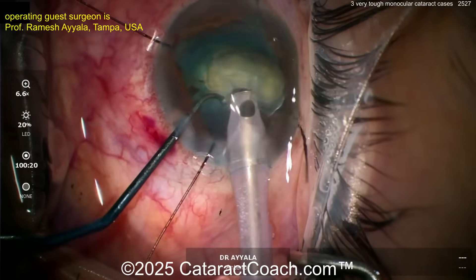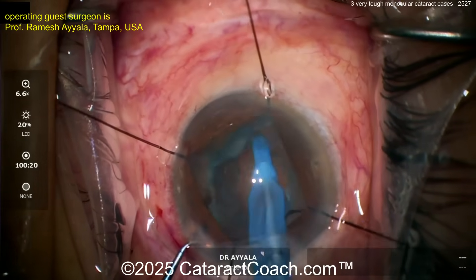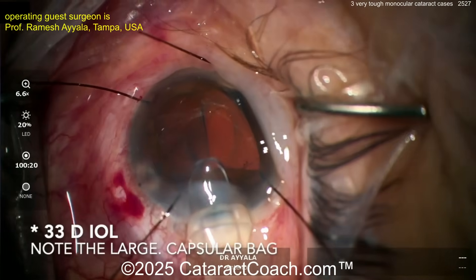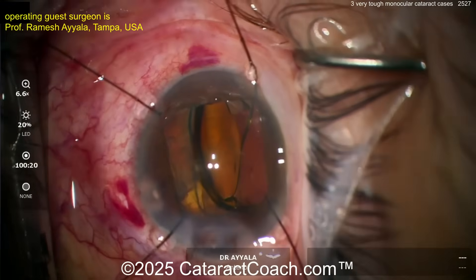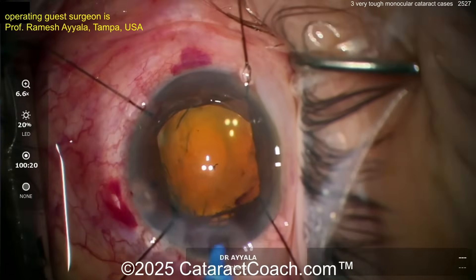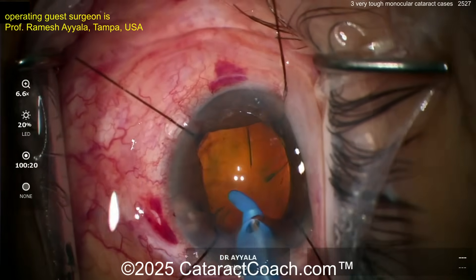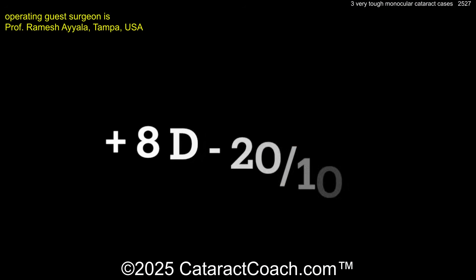It's probably going to be chop, chop, and a lot of chop. Nucleus is out. Here comes cortex removal. Now these videos were pre-edited, so we've cut through it pretty quickly. At the end, let's fill up the bag and put the lens in. In case you're wondering, the highest power lens you can get in the US is 40 diopters — this is a 33-diopter lens going into the capsular bag. Look how massive that lens looks; that's a 6mm optic but look how big it looks inside that eye. Super stressful case. Remove the viscoelastic — be careful of zonulopathy. There is zonulopathy; be very careful. Maybe you want to put a CTR — look how loosey-goosey that is. Multiple sutures here to close it. Super stressful.